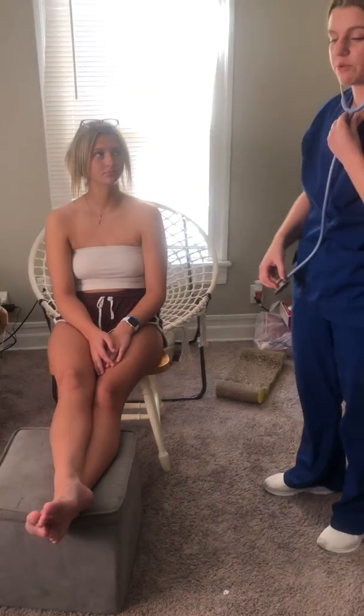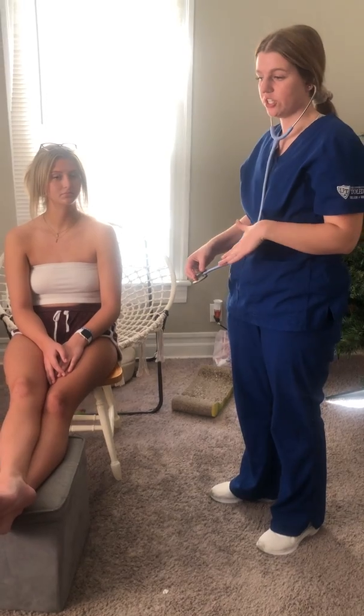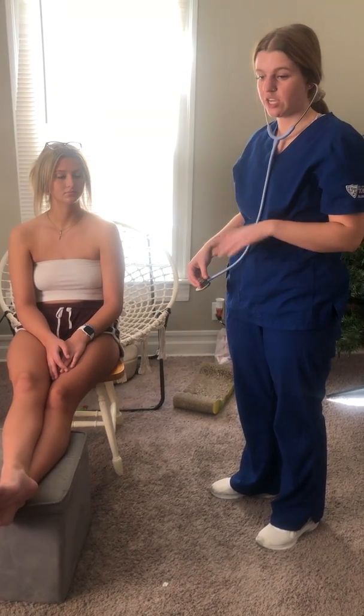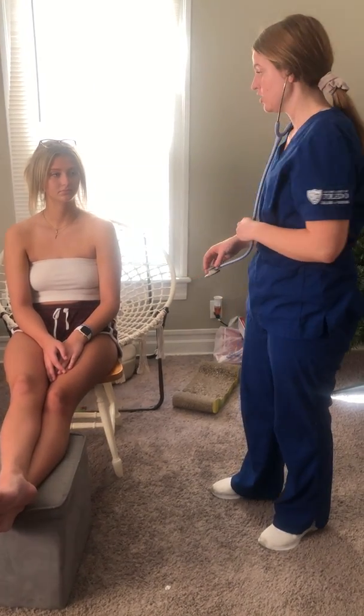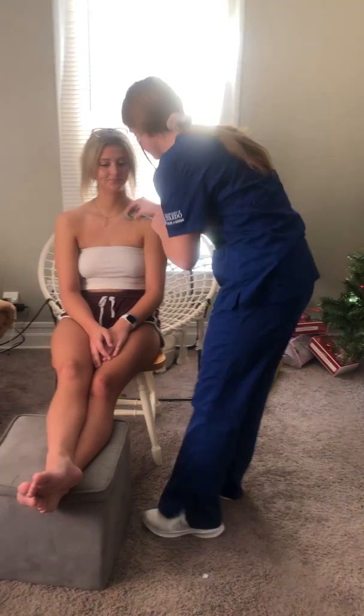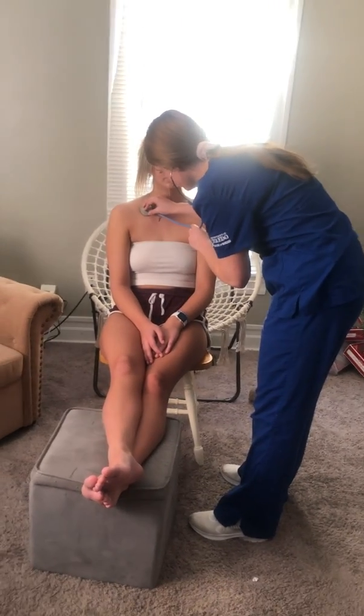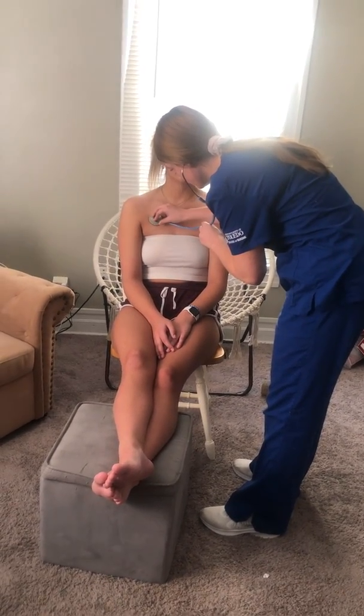The next thing I'm going to do is listen to her lung sounds by doing 10 positions on the front and back to see if I hear any rhonchi or wheezing. So Morgan, I'm going to have you take a deep breath every time I move my stethoscope. All right, deep breath. Deep breath. Deep breath.